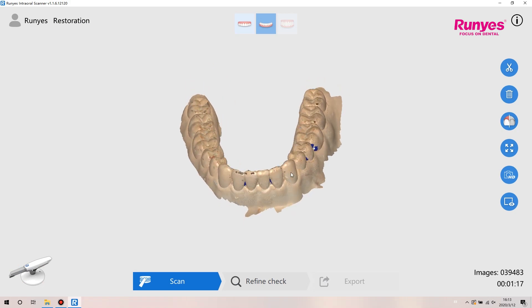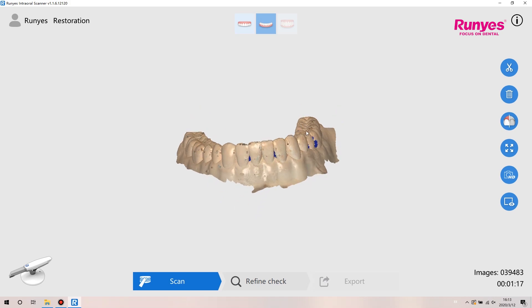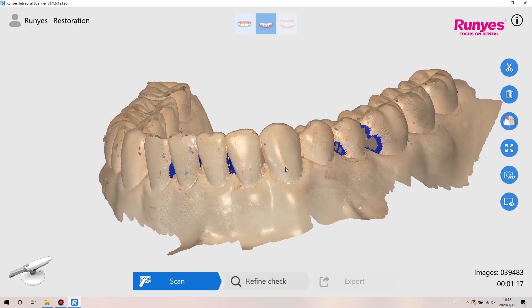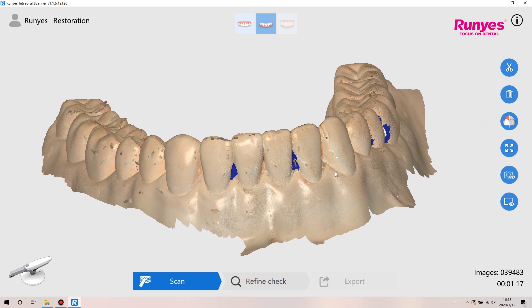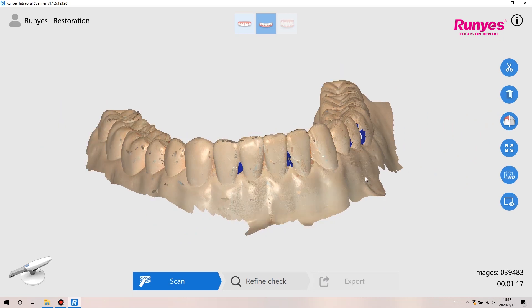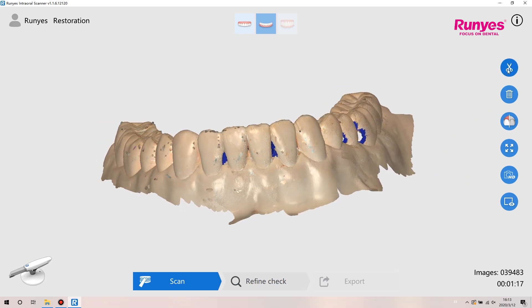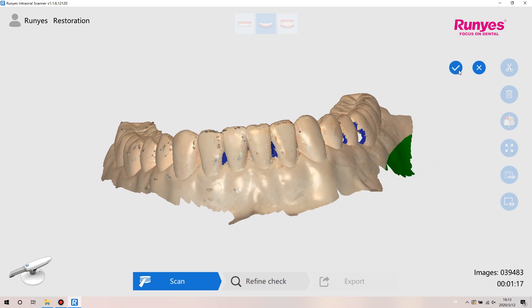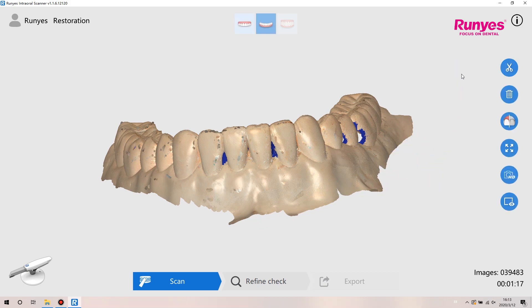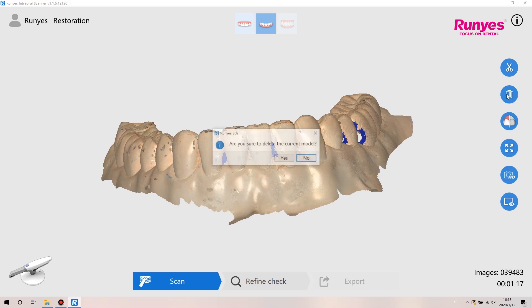If any of those areas are relevant for the given work or scanning protocol required by your lab, they should be scanned again. Select the cut function on the right toolbar — you can select unwanted areas to cut. If the scan result is not good, you can click the delete button to delete the data and scan again.